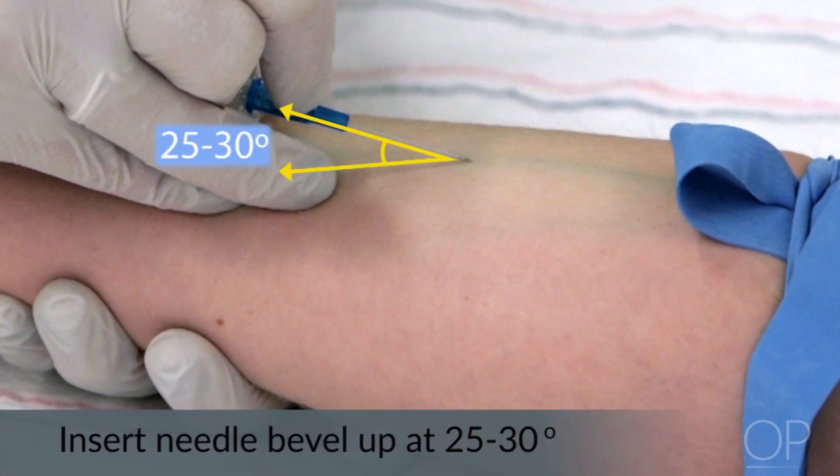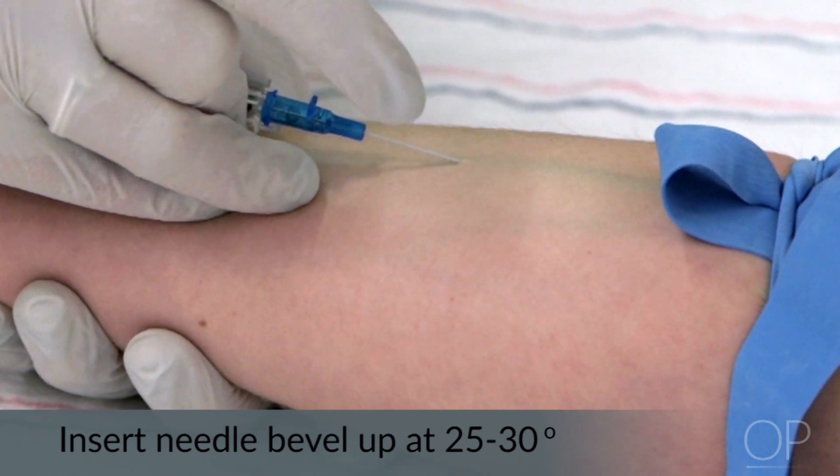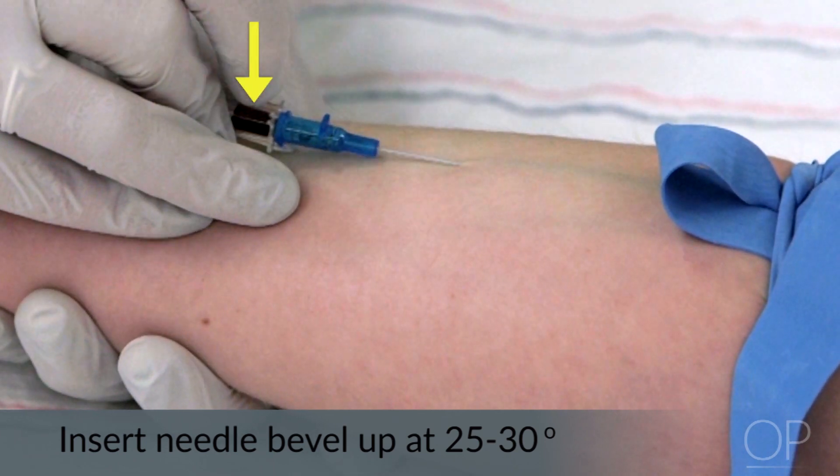Next, you will want to puncture the skin using a 25 to 30 degree angle initially to access the vein. Insert the IV slowly to avoid going through the vessel. Look for a flashback of blood in the catheter as an indication that the IV is in the vessel.